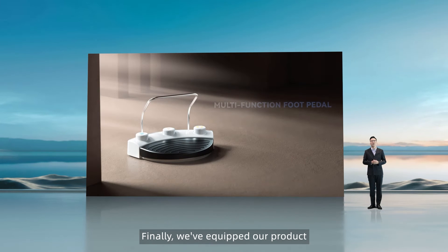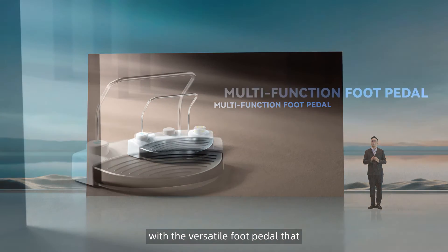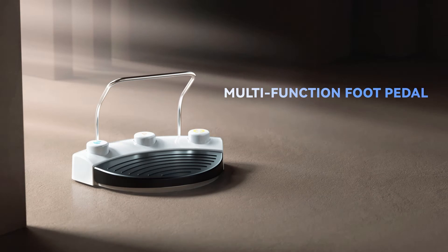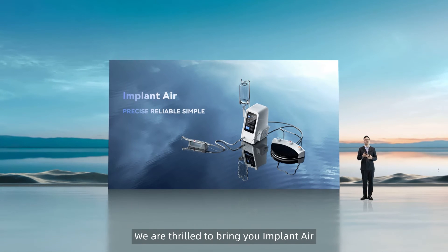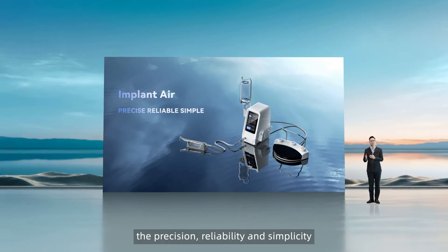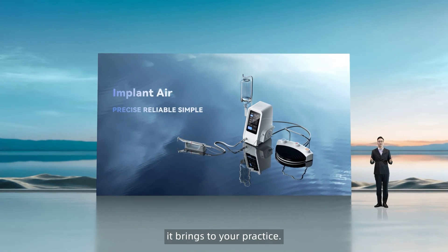Finally, we've equipped our product with a versatile foot pedal that greatly enhances flexibility and efficiency during operation. We're thrilled to bring you ImplantAir and can't wait for you to experience the precision, reliability, and simplicity it brings to your practice.